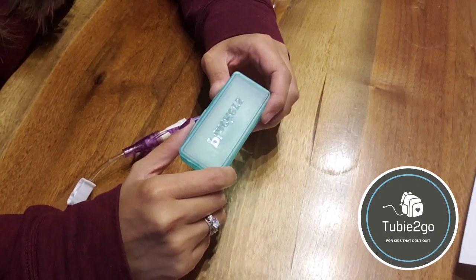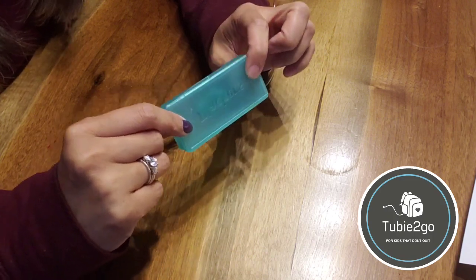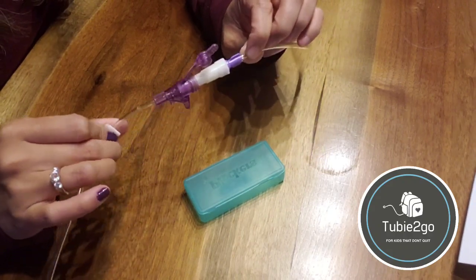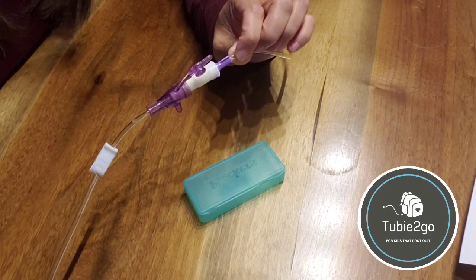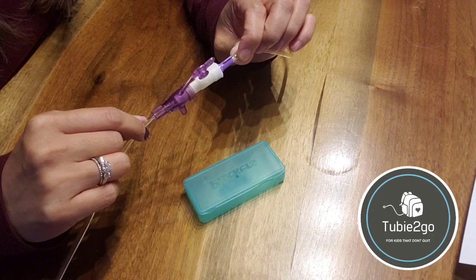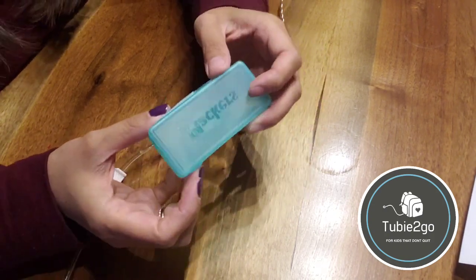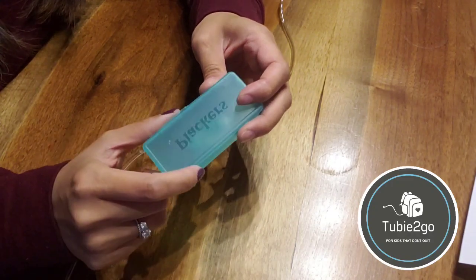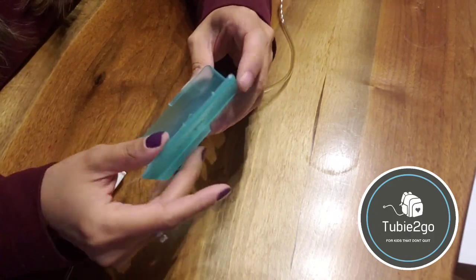Anyways, this is a DIY option where you find a container that is a suitable size for your particular pairing of tip, feed bag tip, and extension, whether you have a PEG type extension or one of the classic mini or Mickey type feed sets. But what you can do is find a container, whether it's a soapbox container, some sort of toothbrush container. This one is for flossers.